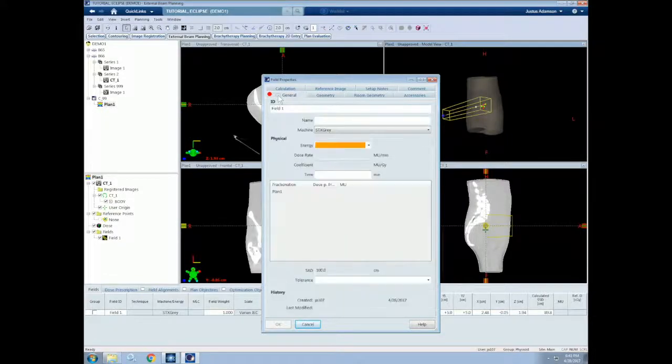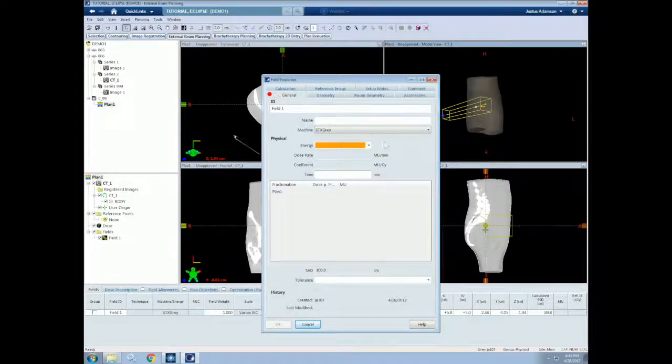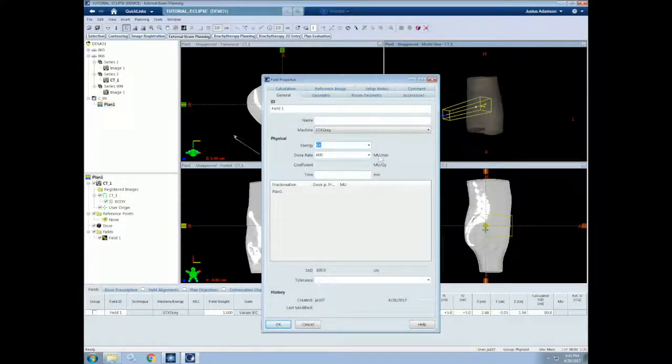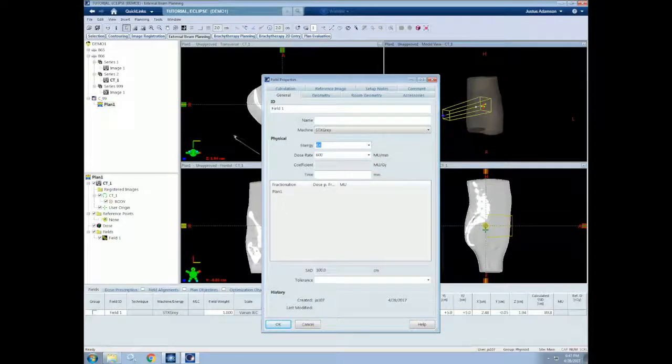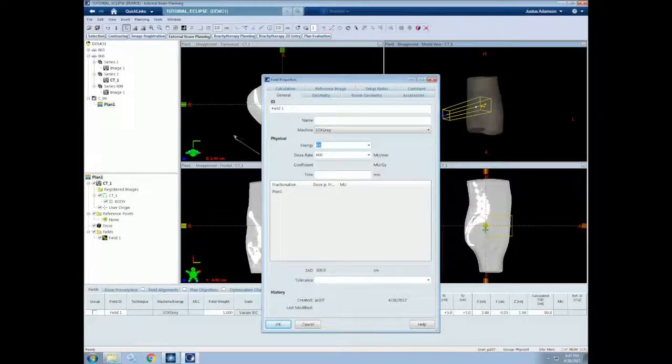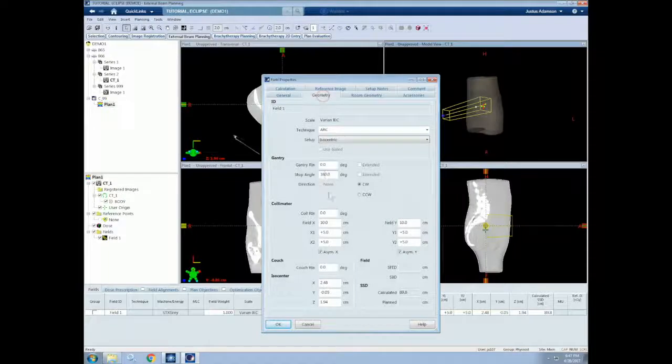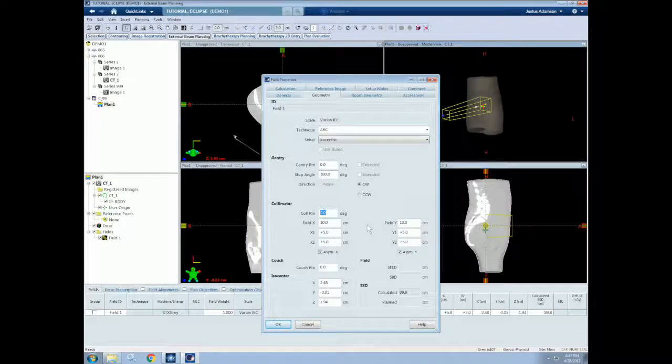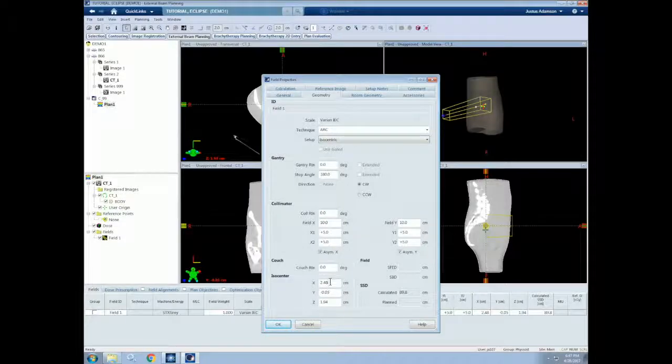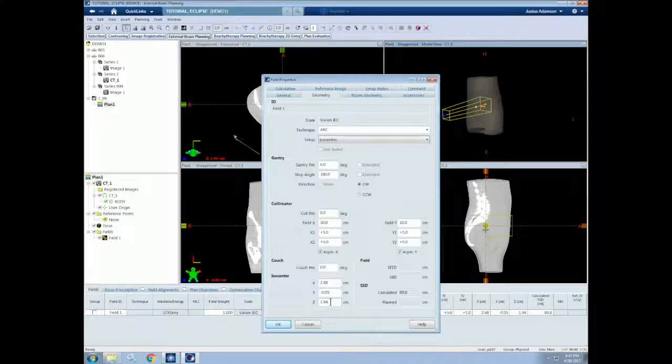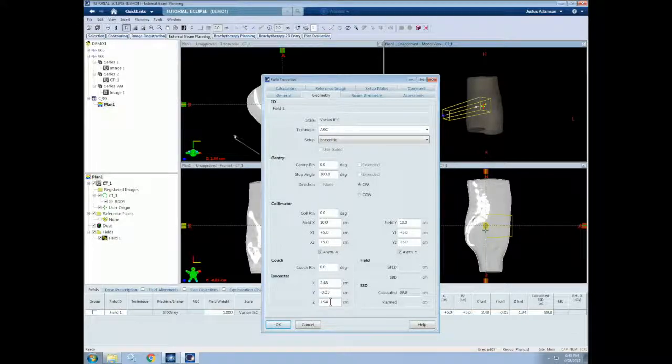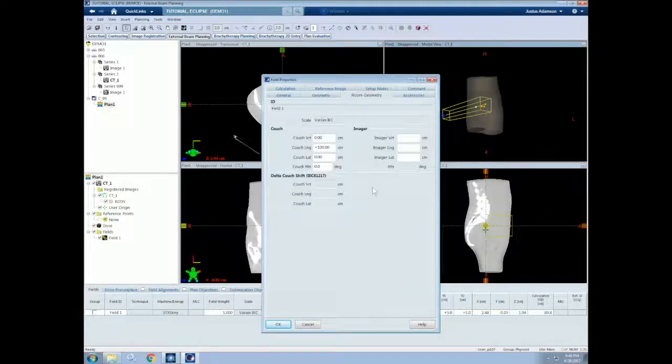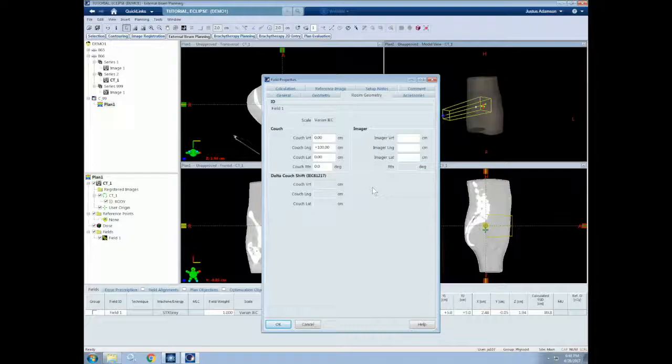For all beams, we will need to enter the beam energy and the dose rate. For now, let's choose a 6X beam with a 600 monitor unit per minute dose rate. These are all the basic inputs necessary for creating a beam, but let's see what else we can do. We can edit the collimator parameters, such as the collimator rotation and the field sizes defined by the jaws. We can also change the couch rotation and the isocenter for the current beam. All these parameters are also accessible through the fields tab at the bottom of the screen as I described in the first tutorial.